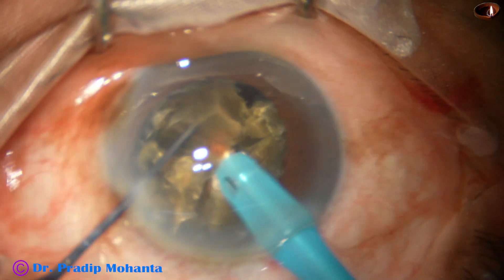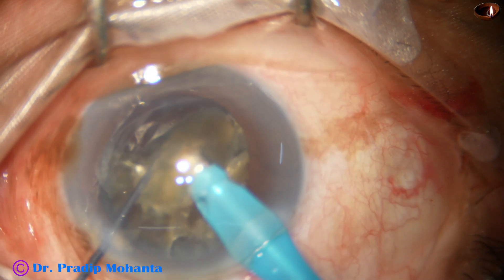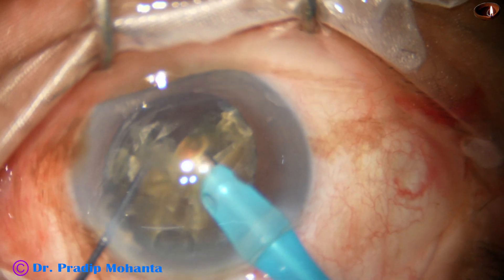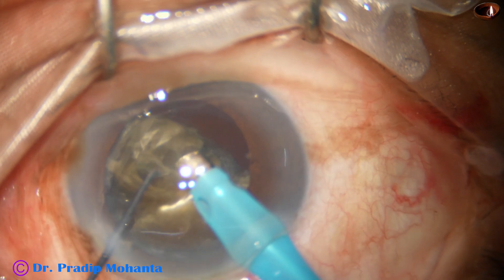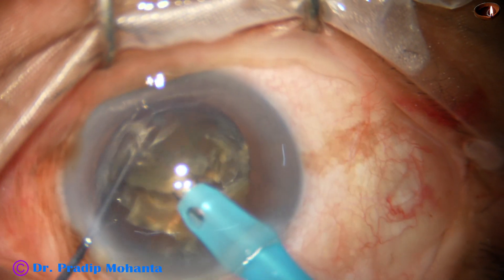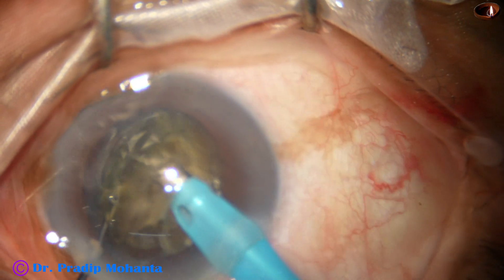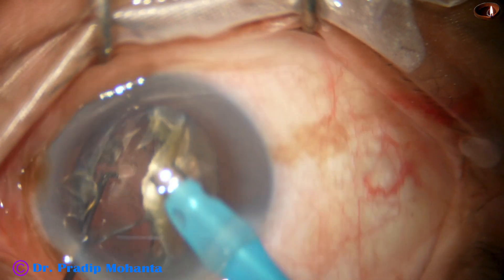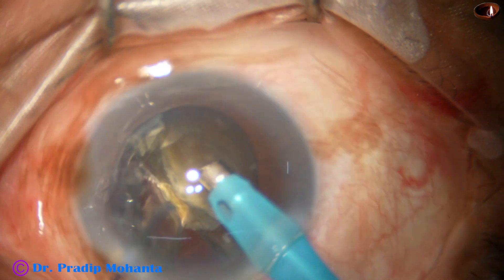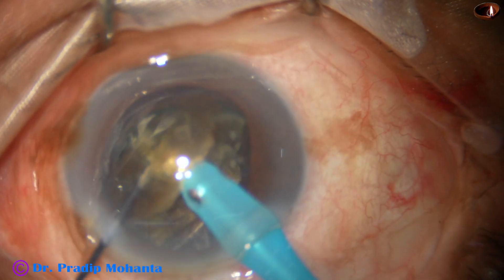Now emulsifying this fragment to get space for movement of the other pieces. Now see the concept of using the epinucleus as a contact lens in such cases with weak zonules. I detach the epinucleus from the nucleus and use the epinucleus shell as a contact lens — the epinucleus shell is just under the chopper. I did not remove the epinucleus; let it support the capsule for some time.